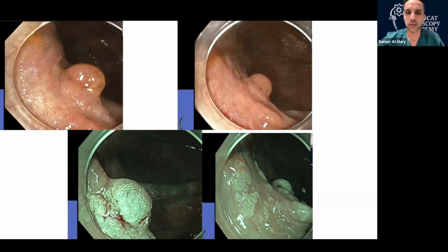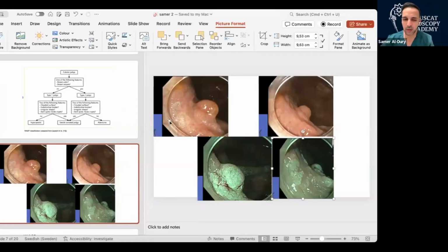This is fantastic pictures, because this is really exactly what I mean. Most of the time, most of the polyps, the SSLs, will not have that adenomatous component. But seeing it makes you never forget it. And really, it's important to start with seeing them and then choosing the right modality for that. So I really agree with you there.